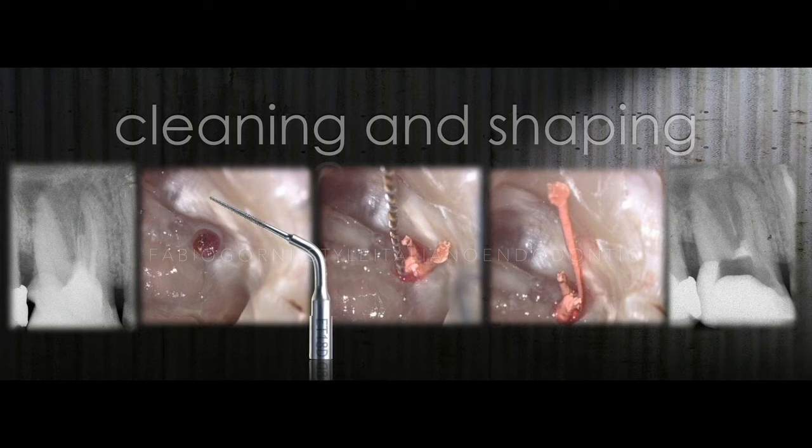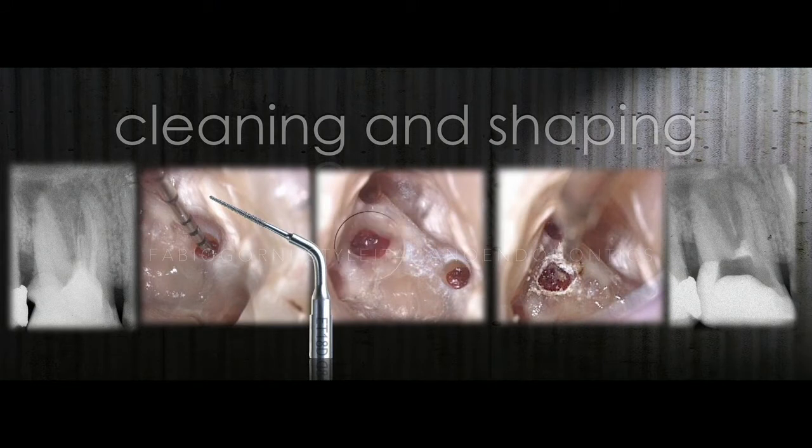After that, we have to clean the dentinal wall of the perforation, and we have to understand if the thickness of the defect is enough to maintain our material. In this case, we have two different situations. The palatal perforation is correct in shape, but the other one is not. So we have to change the shape of the perforation. We have to make the perforation a little bit bigger, but we need a thickness of the dentinal wall that can receive the material, and this is one of the most important aspects of the technique.